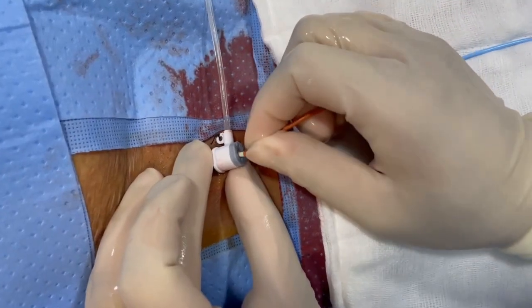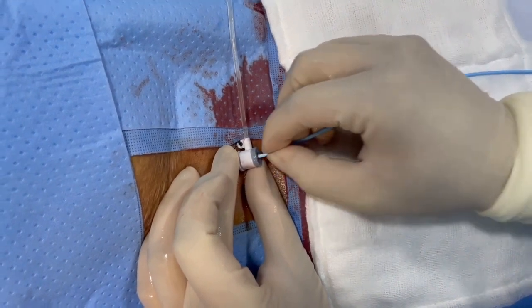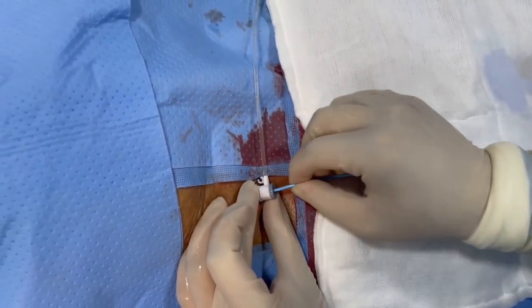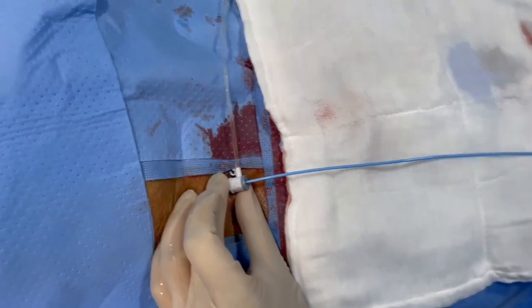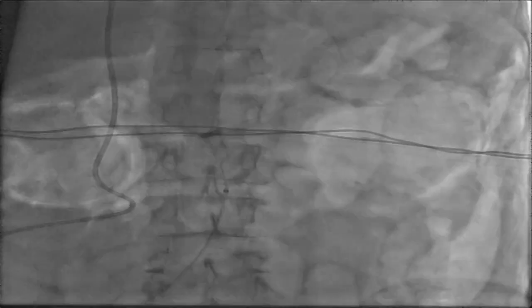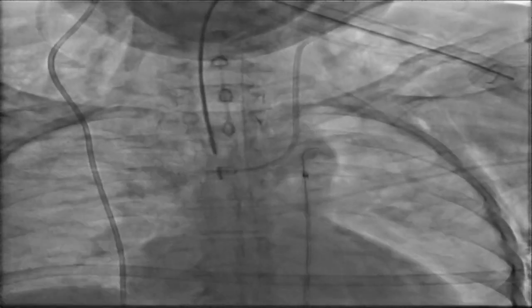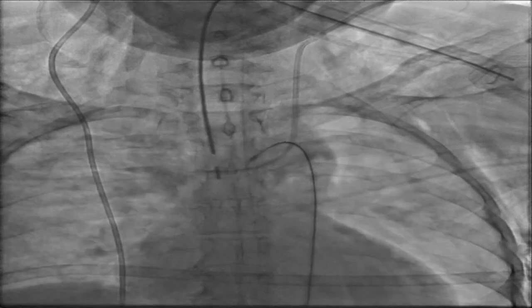The catheter with Terumo wire is introduced through the femoral sheath and advanced over the wire, which forms a support system. We should ensure that the wire is ahead of the catheter by not less than 5 cm. The catheter over the wire is advanced up to the arch of the aorta under fluoroscopy. We take an arch aortogram to see the origin of the vessels. Generally, arch aortogram is taken only in difficult cases. We take a roadmap, turn the catheter tip upward, and advance the Terumo wire in the common carotid artery. After that, we advance the catheter over the wire in the common carotid artery.